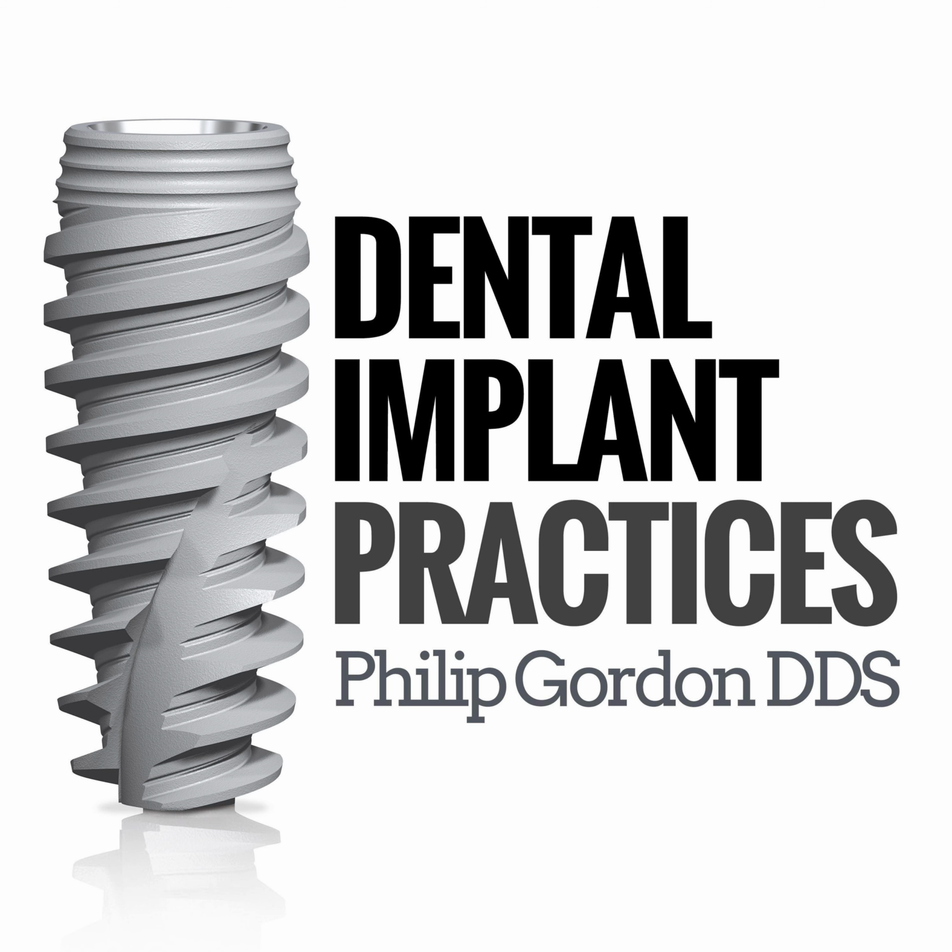So I get this thing back. It's got all these parts. I walk through it maybe with one of your implant planners. I feel good about it. I've got the patient coming in, so we've got the surgery day. Kind of walk somebody through what we've got. Let's just say I've got the teeth, and are you maybe going to do a bone reduction guide? We're going to be extracting the teeth, placing the bone reduction guide, leveling off the tops of that, and then placing our implants through the guide. Is that kind of the process?